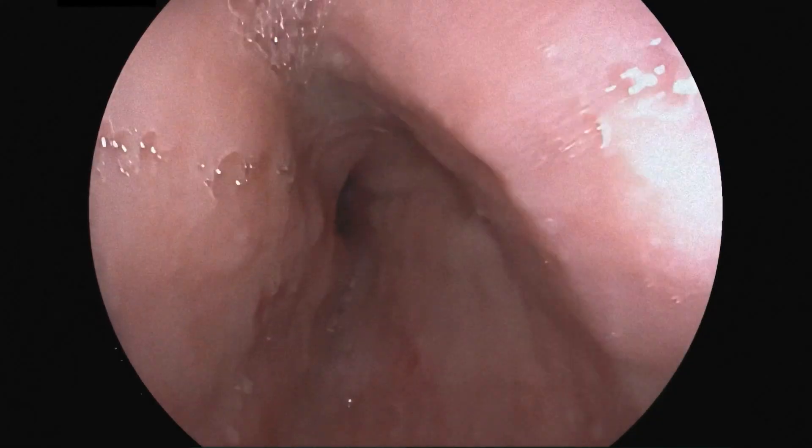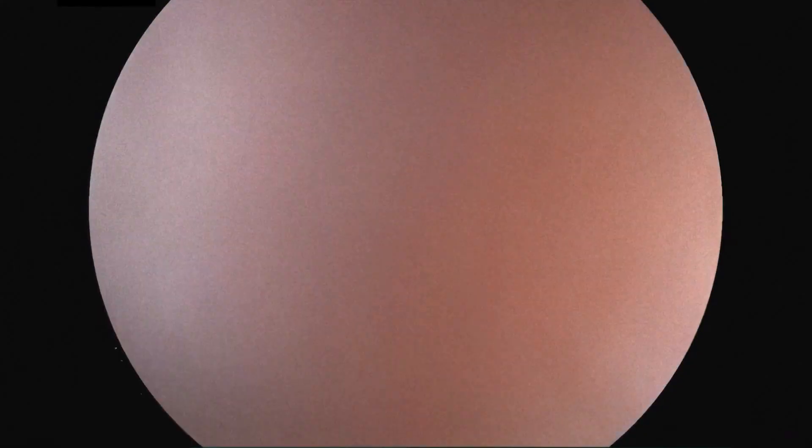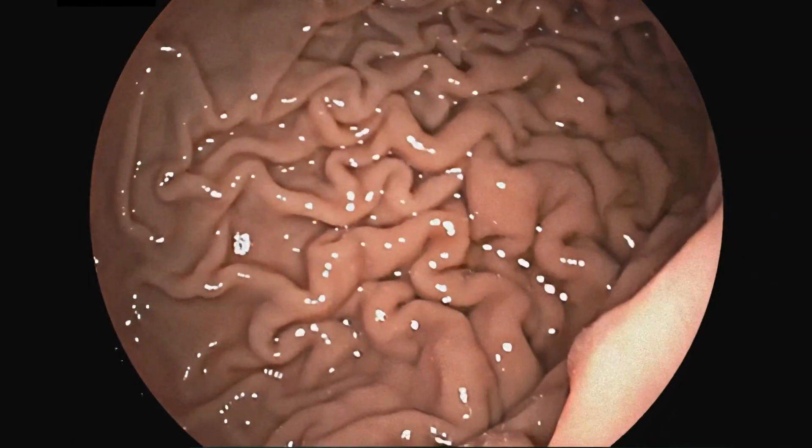The scope can be used for diagnostic purposes to view or biopsy the lining of the small intestine, which is not typically visualized during endoscopy, or to perform certain therapies.